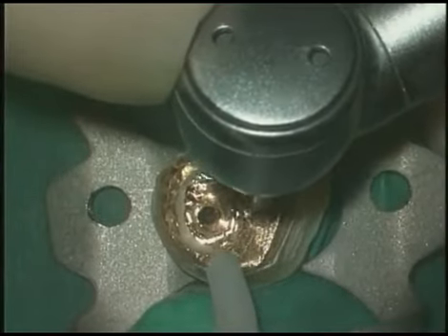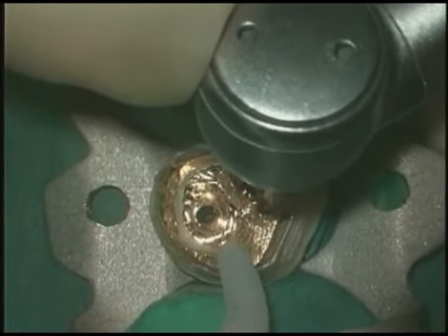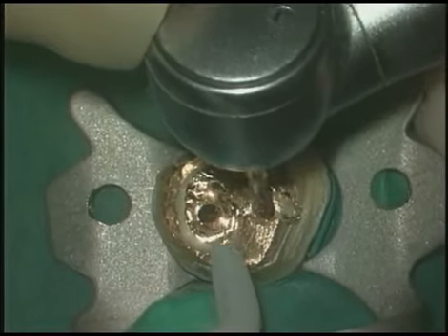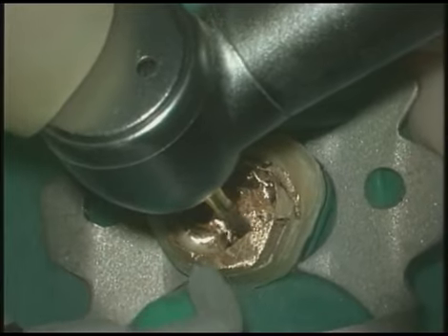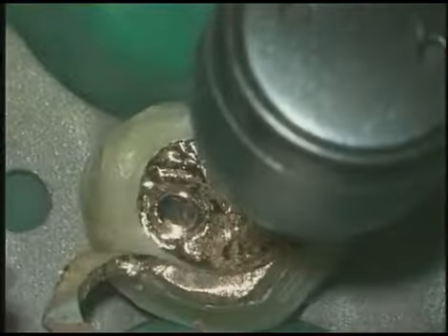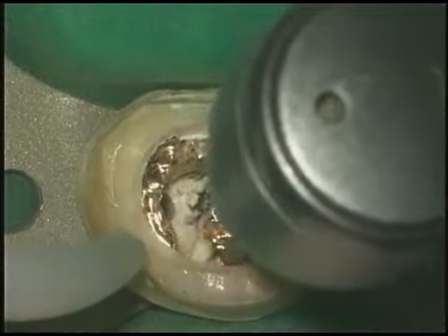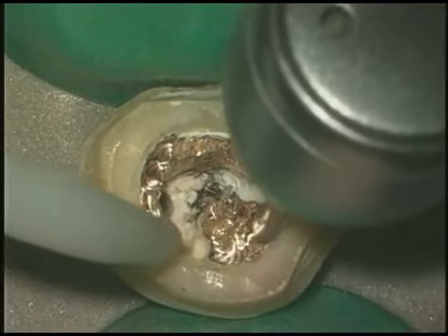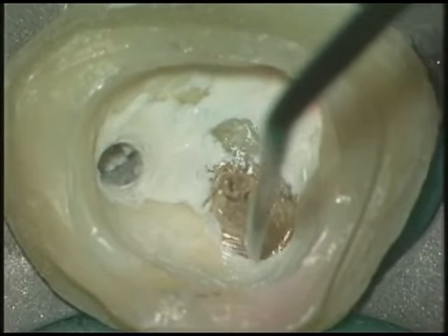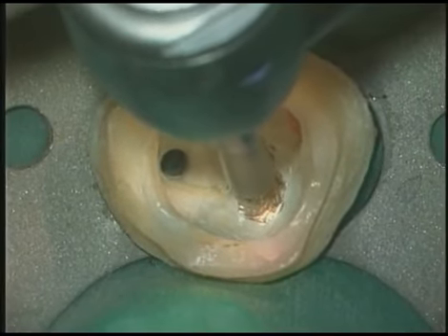Now we need to progressively remove more of the core to free up the post in the distal buccal. Learn to simplify. Section buccal to lingual to divide the core into mesial distal halves. This not only improves vision and access for the burr, but it will facilitate ultimately the safe removal so that we maximize remaining tooth structure. Learn to brush cut and keep the burrs off the pulpal floor. Let's keep our burrs off this area because it would be easy to inadvertently perhaps perforate the furcal floor.